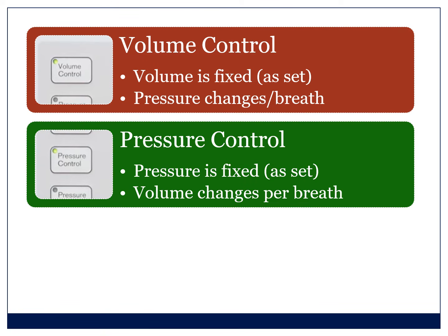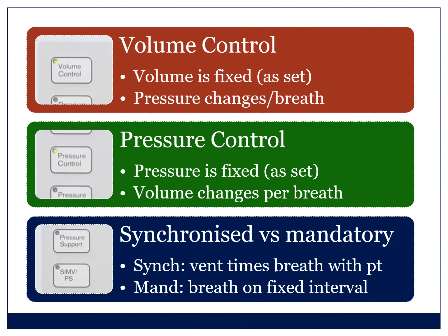The one that patients tolerate a little bit better, and the one which is probably slightly physiologically better, is pressure control. But I'm very happy that you start with whatever everyone in your institution is used to and get to know one mode, get to know it well, and then start playing with the other mode once you're comfortable in one of the modes.